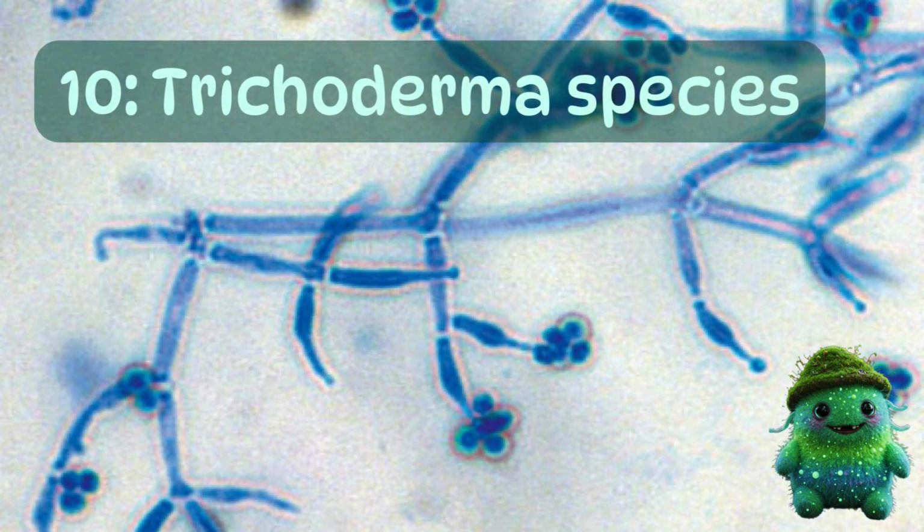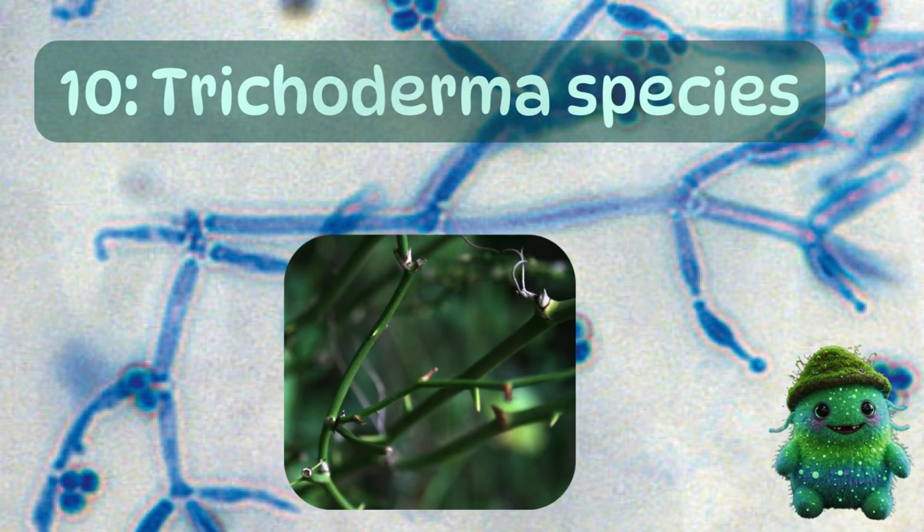Last and not least, we have the beautiful grassy-looking Trichoderma. This hyaline mold has the same structures as Penicillium, but the phialides are at wide 45-degree angles from one another, and the conidia are actually in small clusters as opposed to chains. It kind of resembles briar patches.